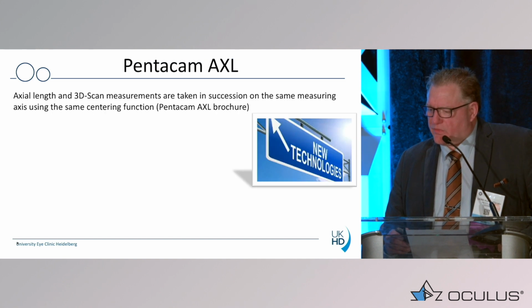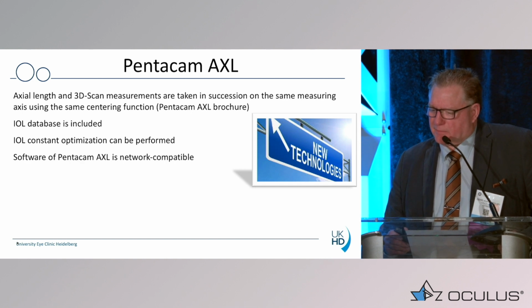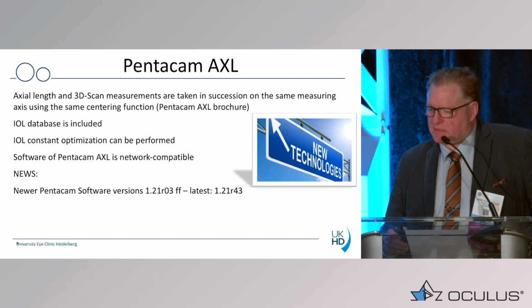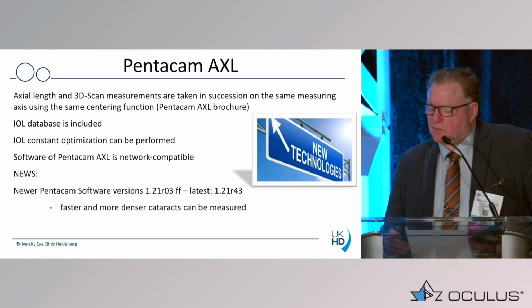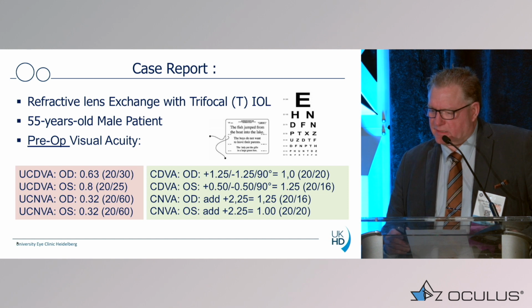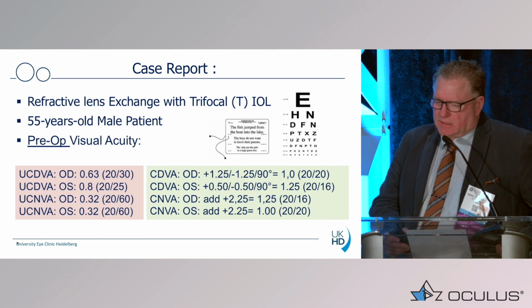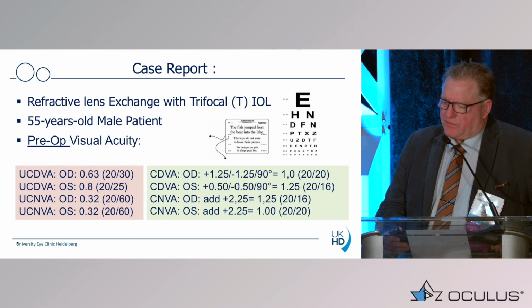And with the new technologies that arise from the Pentacam, we are completely independent from other devices such as the IOL Master 700, which we use, and the whole IOL calculation process is now on the same level as we had it. So let's look here at a typical patient that can come in our clinic.